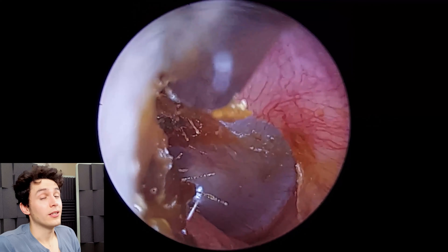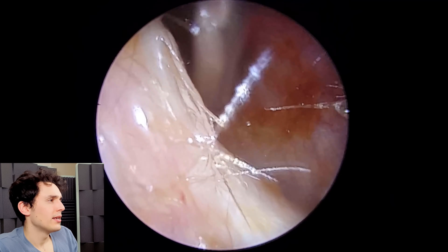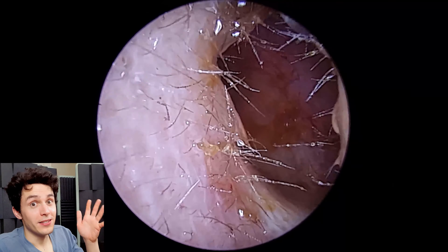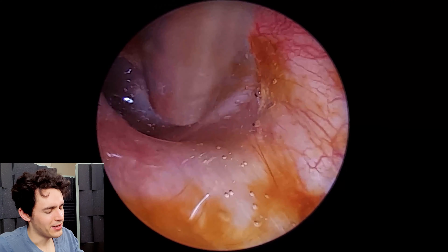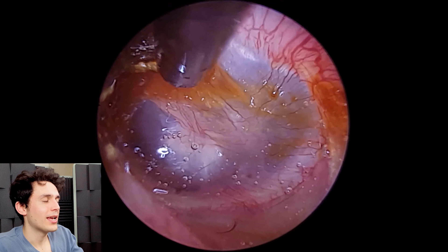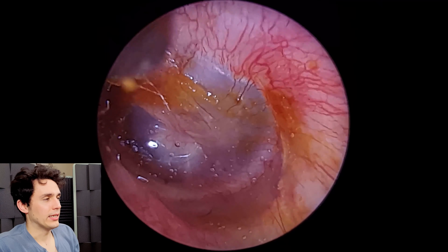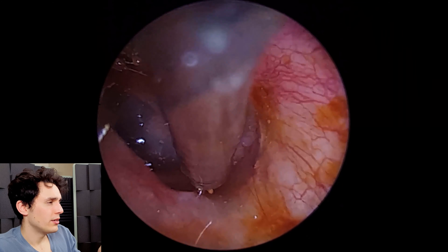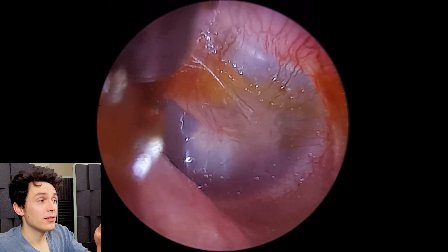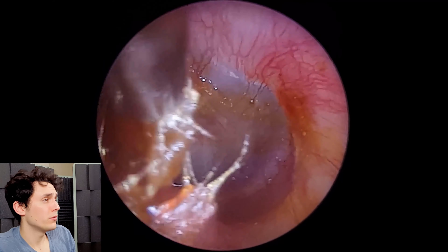The third layer at the back is a mucosal lining. I've applied a little more olive oil to try and get some purchase on this. The endoscope — honestly this is the bane of my life — the end gets smeared constantly whenever I apply olive oil, but not to worry. I'm trying to manipulate it but the eardrum is still flexing, which should be avoided since we don't want to do any damage. So I'm going to mop up a little bit of the excess and try to catch it from the side — sometimes if you peel a little wax off the side, you get lucky and it peels all the way down to the eardrum. There's more than enough oil in here now to give me good control.